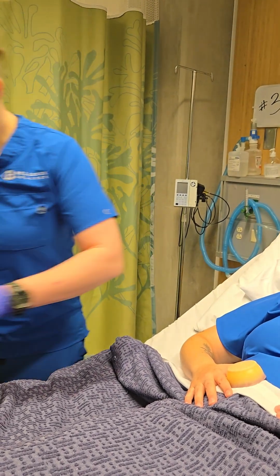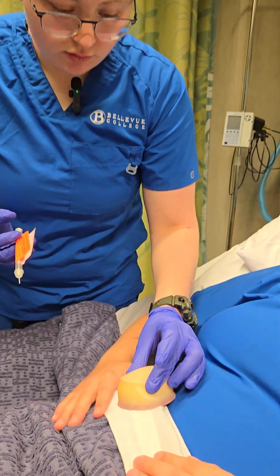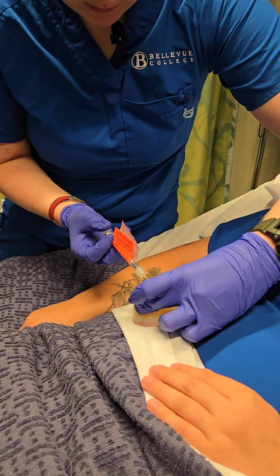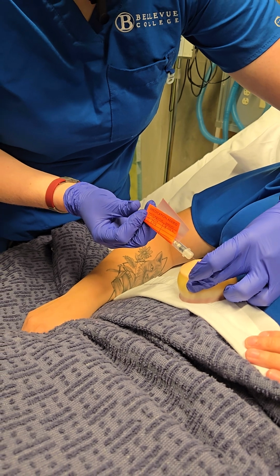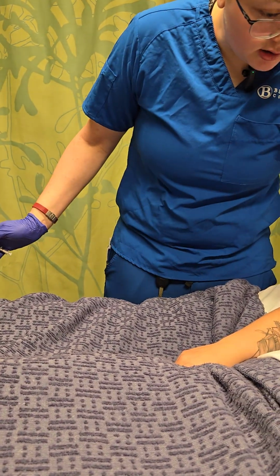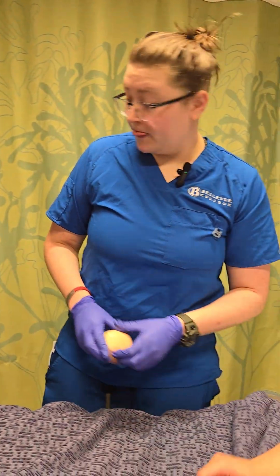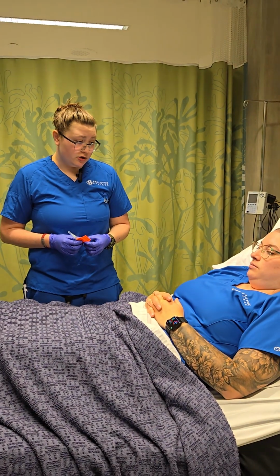Take off the cap. I'm going to squeeze at a 45-degree angle. At a 45-degree angle, 3, 2, 1. Inject. Draw out. Immediately do the safety feature. Safety feature engaged. Assessing for bleeding. No bleeding. Looking good. And this would immediately go in the sharps. All right. As I said, we're going to come back in an hour and a bit, between an hour and 2 hours, and recheck your blood sugar one more time.